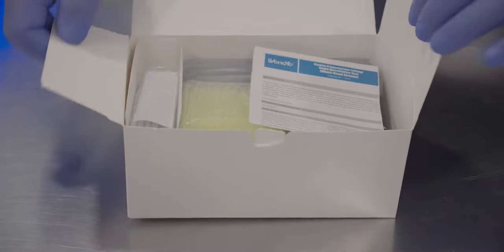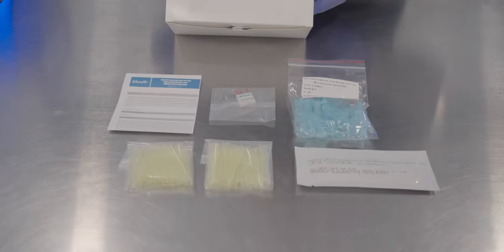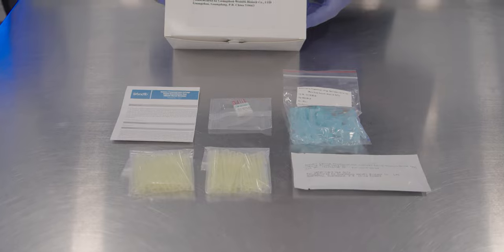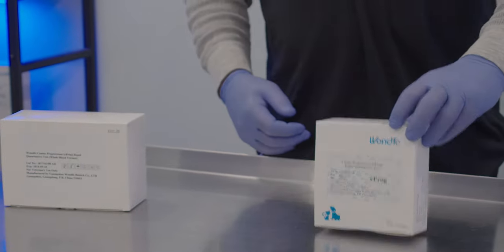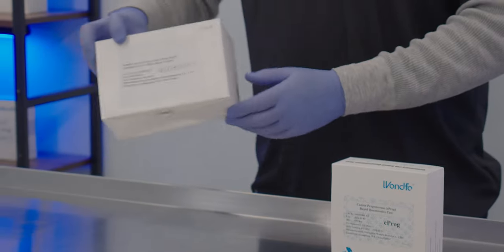The whole blood tests are a great option for saving time and reducing failure rates with hemolyzed samples. They are a little bit more pricey and do come in at $12 per test. The serum WANFO tests come $10 per box, while the whole blood tests come $25 per box.